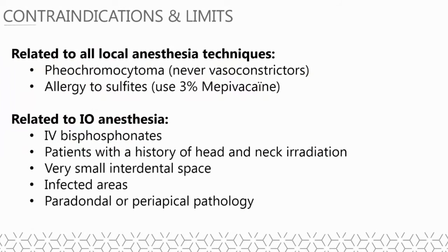Related to intraosseous anesthesia in particular: patients on intravenous bisphosphonate therapy, patients with a history of head and neck irradiation, very small interdental spaces, infected areas, periodontal or periapical pathologies.